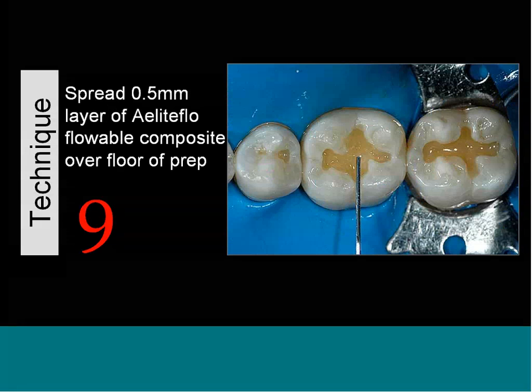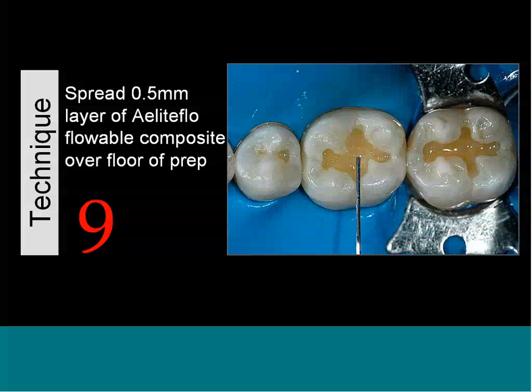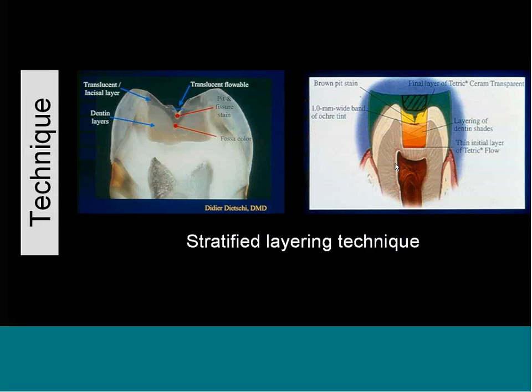So next step is we're going to apply 0.5 millimeter of Elite Flow over the floor of the prep. This is to make sure you don't trap any air underneath the body composite or the dentin composite you're going to use. You're going to spread this over the floor of the prep. You can use an explorer or a perioprobe to spread that over and then light cure it.